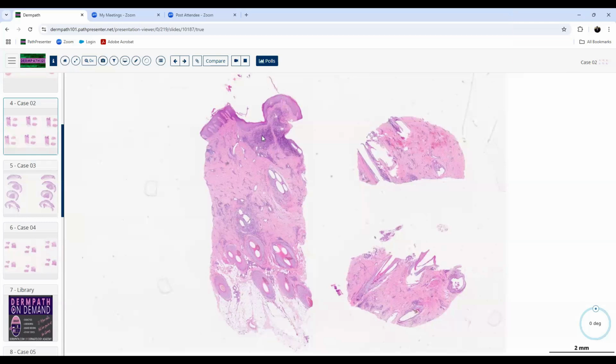That's probably to the side of the follicle. If we cut deeper sections, we probably see a follicle right around that area too. So it seems to be hitting the follicle, not getting everything and just destroying the follicles along the way. Like for example, in folliculitis decalvans, that starts off as a suppurative folliculitis, ruptures, and it just sort of blasts everything. So here it's really going after the individual hair follicles themselves.